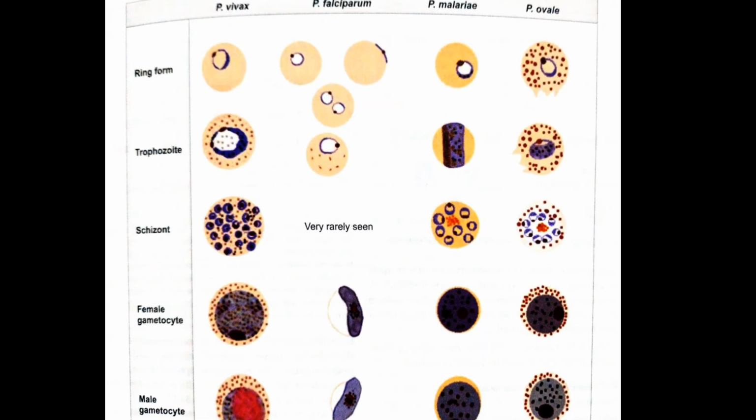Now, moving on to the morphological comparison of Plasmodia. As the image shows, P. vivax shows all the stages. The above picture is showing the ring. There is a blue cytoplasmic ring, which is 1/3 of the diameter of the red cell, and one side of the ring is thicker and the red chromatin is at the thinner part of the ring. It is seen in Plasmodium vivax. And 12 to 24 merozoites arranged in a rosette-like granular appearance are seen in a schizont of Plasmodium vivax.